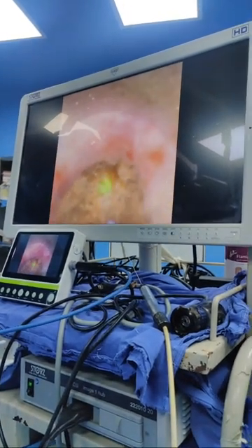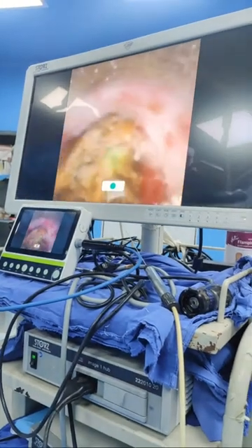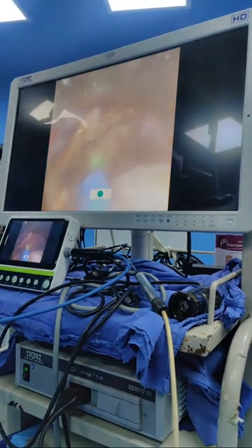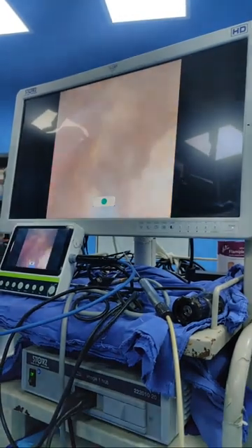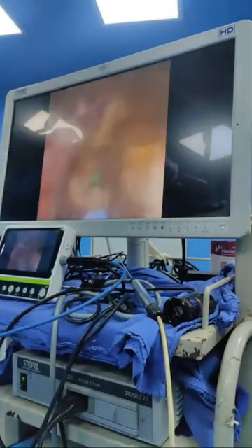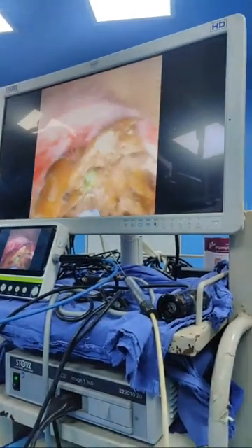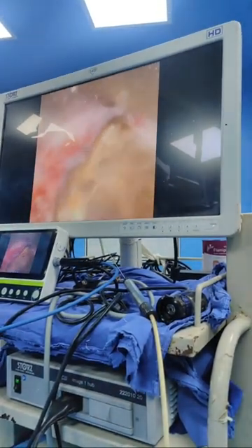We are reaching towards the renal pelvis. So we have removed the one stent. Yeah, the guide wire has been removed, so that the stones come out easily. The safety guidewire should never be inside the sheath, it should be outside the sheath. Then the flow of the water, control of the suction, the fragment removal, all becomes very easy. Then the fiber, the guide wire would block the exit of the stone through the sheath.